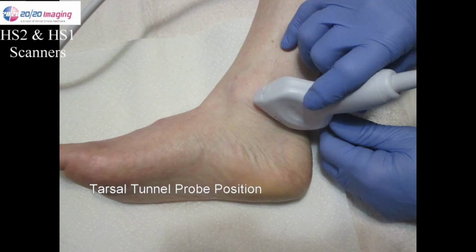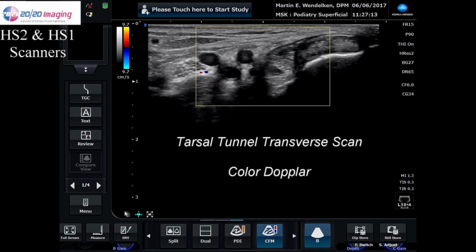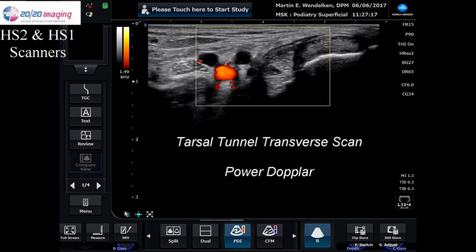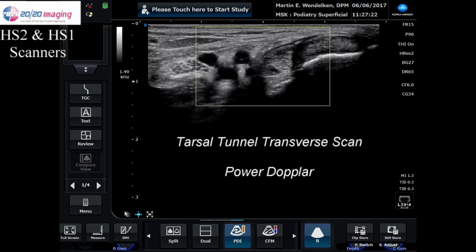Here I'm demonstrating the view, and now we're going to apply the color box to this so you can see the flow in the artery. If I squeeze, you just see the veins. So you can augment flow, and now I'm in power Doppler, which is a little bit more sensitive.